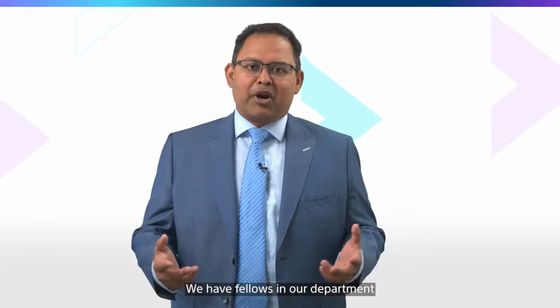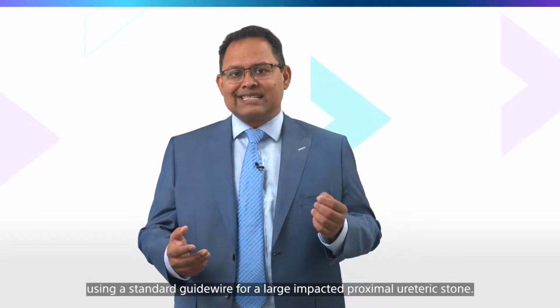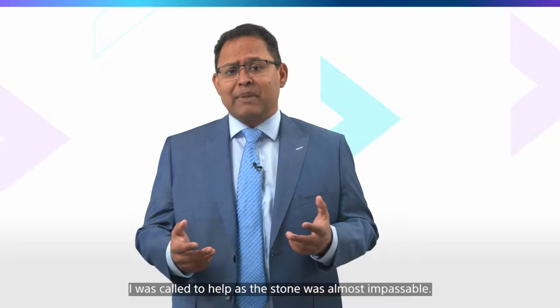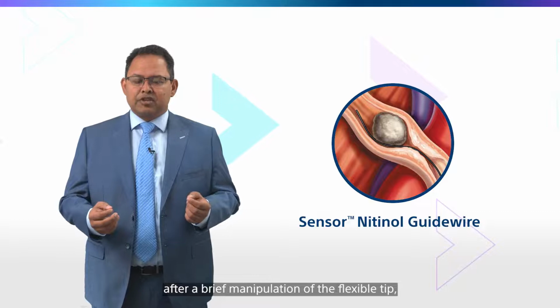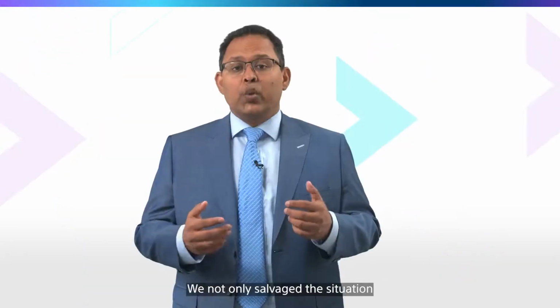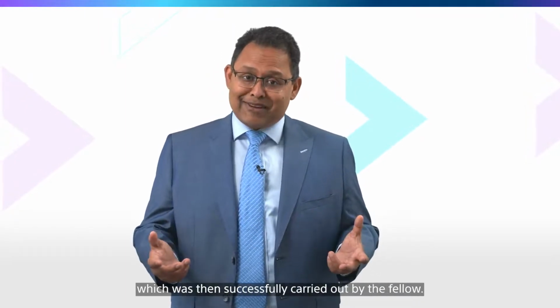We have fellows in our department who come for training from different countries. I remember a case where one of our new fellows was using a standard guide wire for a large impacted proximal ureteric stone. I was called to help as the stone was almost impassable. I asked for a sensor guide wire, and after a brief manipulation of the flexible tip, the wire was able to bypass the stone and was placed in the kidney. We not only salvaged the situation, but were also able to proceed to the stone treatment, which was then successfully carried out by the fellow.